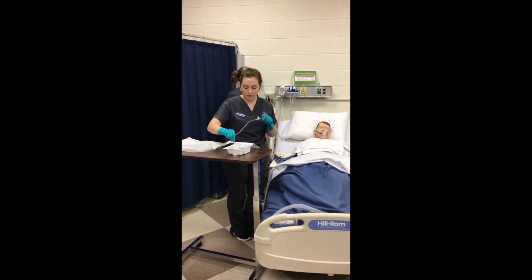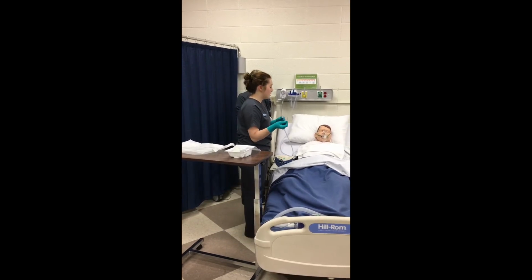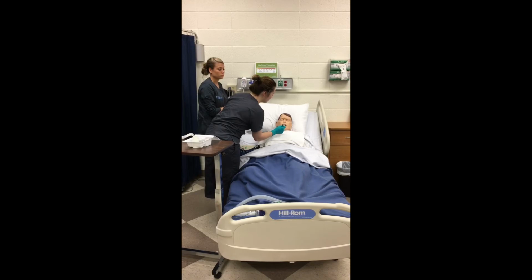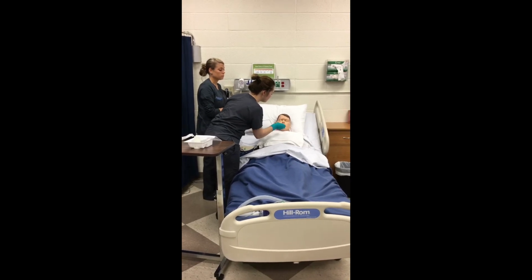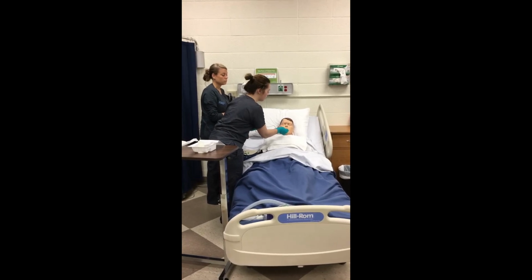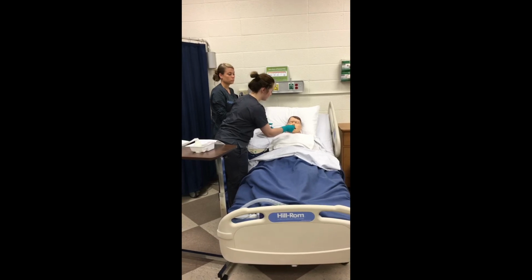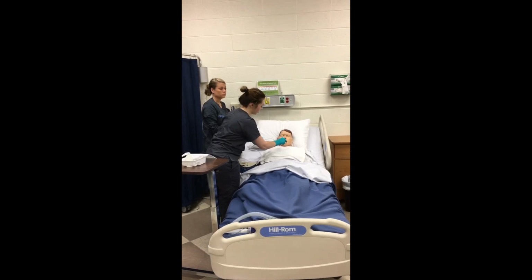Okay, I'm going to lubricate the tip. And now I'm going to instruct my patient to take 3 to 5 deep breaths before I insert the suction catheter. Okay, now I want to insert quickly but gently, 12.5 centimeters. To prevent damage to the mucous membrane at the bifurcation, I will remove 1 to 2 centimeters before suctioning. And now I'm going to intermittently suction while twisting the catheter every 10 to 15 seconds.